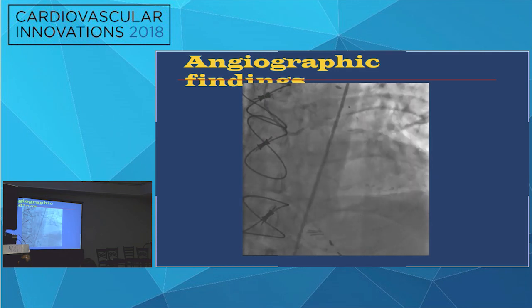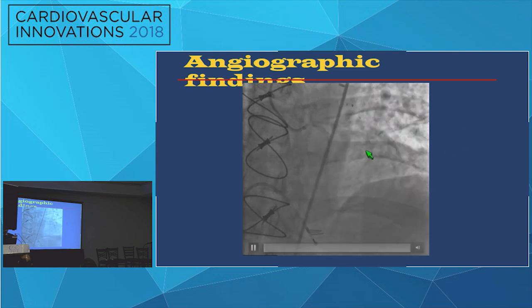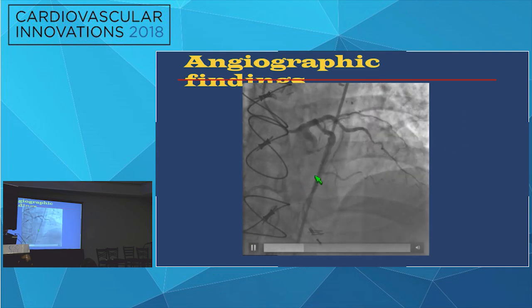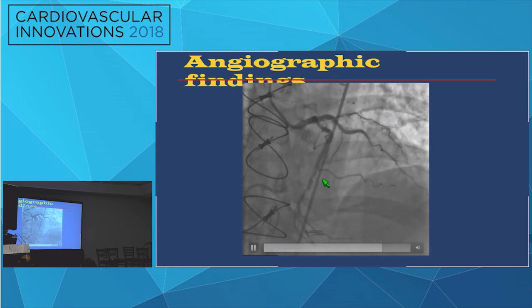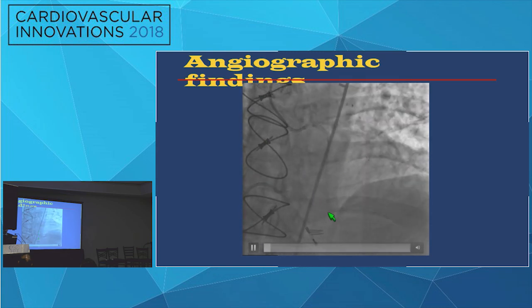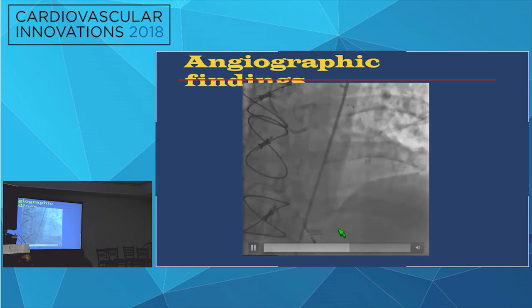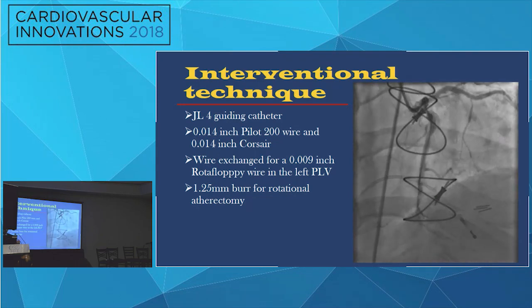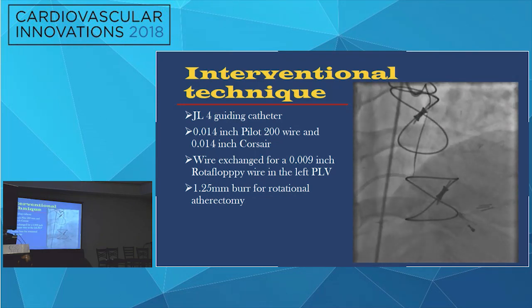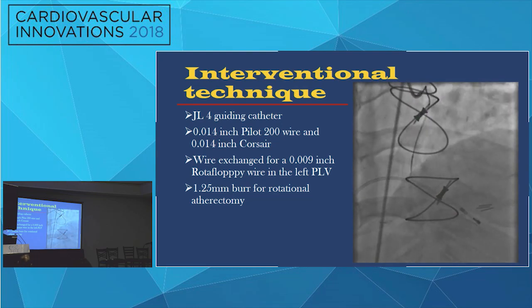So this is a left angiogram showing the left circ with a densely calcified artery, right proximal to all these PLVs and PDA. There is no competitive flow seen here. That graft was known to have closed before 2013. So I proceeded with what I thought would be a regular intervention.